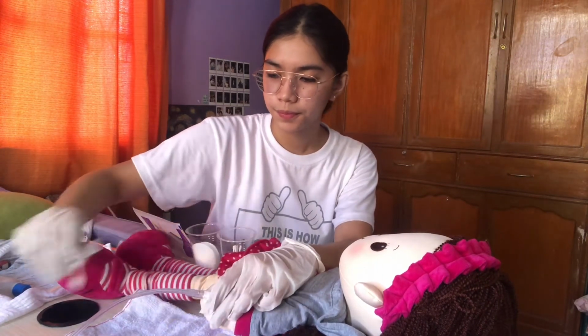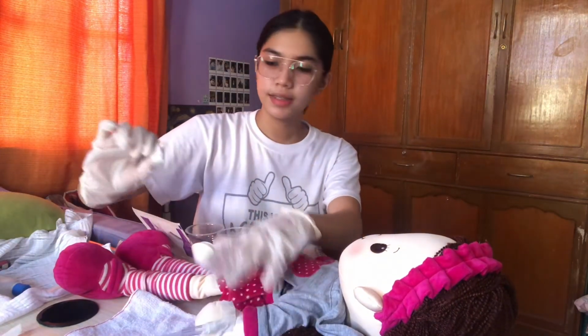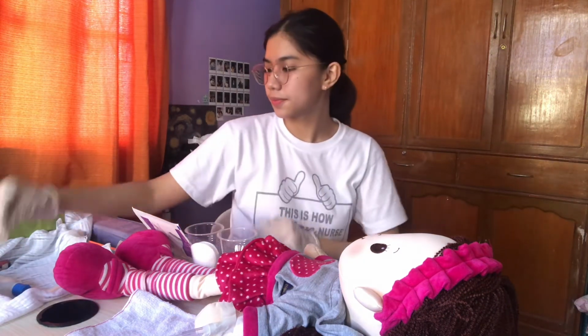So, ma'am, alisin ko na po. And discard the used dressing materials in the appropriate container. Assess the IV site. We will now inspect the IV site for presence of infiltration or inflammation, or go to step 8, or discontinue or relocate the IV site if indicated. Ma'am, may I touch your hands? Okay, thank you. Okay, ma'am.